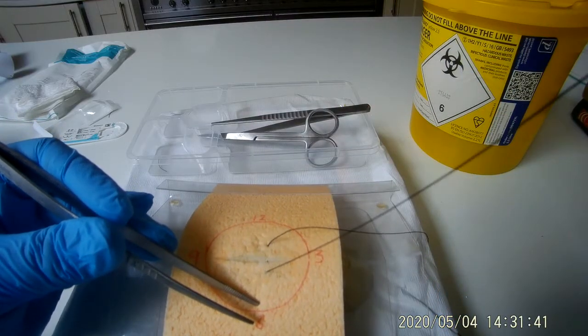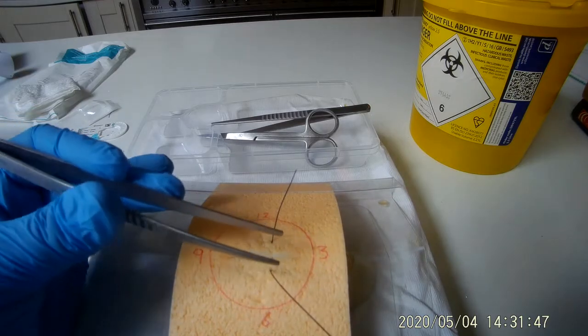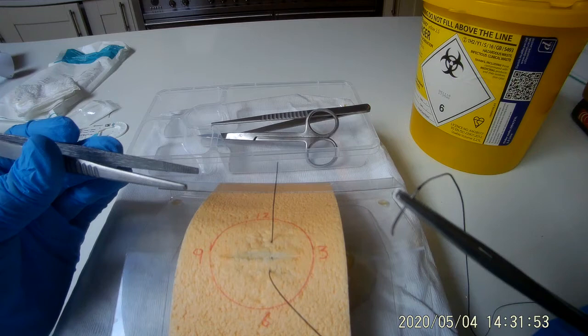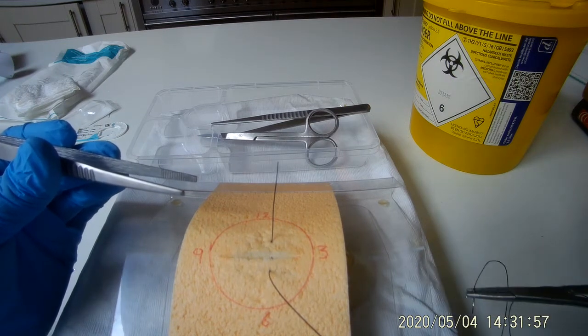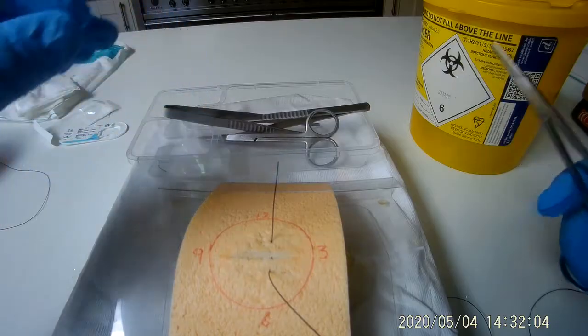Pull the thread through until you leave a small tail, approximately 2 inches long, like this. Put down the non-toothed forceps.